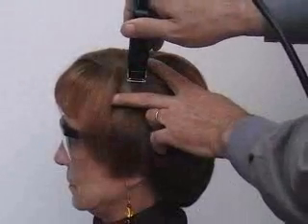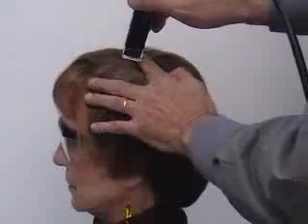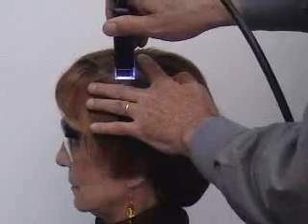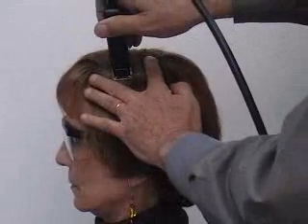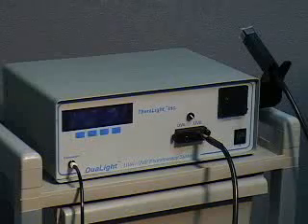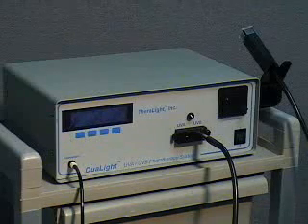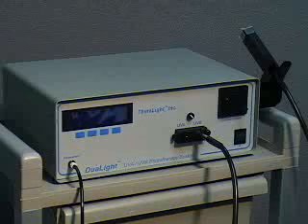In addition to elbow and knee disease, the dual-light is particularly useful in the treatment of scalp disease. Simply part the hair with the fingers and step on the foot switch to deliver the desired dose of UV light. That completes a quick demonstration on the use of the dual-light system. The following information is provided for individuals who wish to learn more about its features and controls.